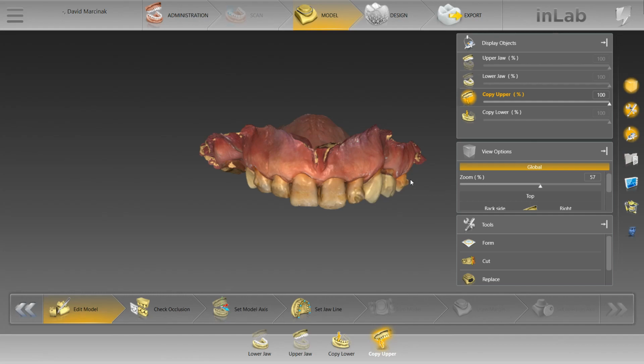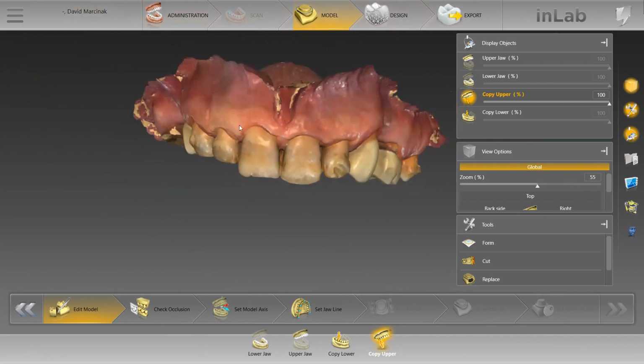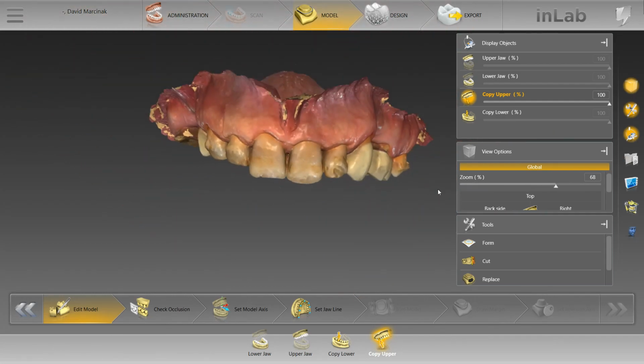So another requirement for a wax-up is a pre-op photo. Pre-op photos typically of the patient smiling, that's good enough. You could do the lip at rest, a side profile view, all that jazz. But when I'm doing a diagnostic wax-up or a smile design, I'm typically just looking at the photo of the patient smiling. And then, based off of that photo, I'm not going to show you this patient's photo just for confidentiality purposes, but they needed improvements. This jaw was oriented, I would say, about like this. It was kind of crooked. So we leveled out the occlusal plane with this wax-up, and I'll get into that.